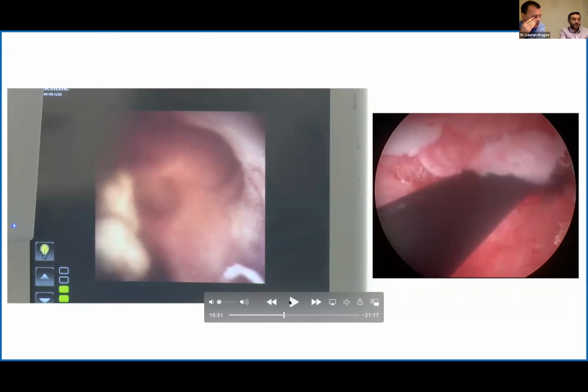Yeah, great. You have to pay attention whenever you try to do this. You were saying about ureteroscope, weren't you? Yeah, so I've never used it, so they say they can. Yeah, the thing is, be careful to make sure that your probe is long enough to go out through the scope. So you have to take into consideration not just the working channel of the semi-rigid ureteroscope, but also the other part. So altogether, it has to be shorter than the probe.